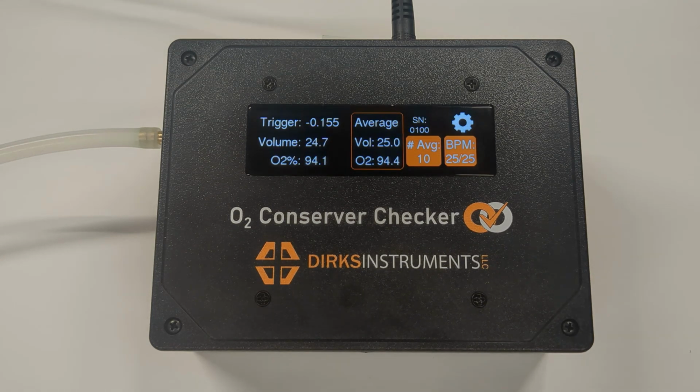On the top right section of the display, we have our serial number for the device, as well as a small area that will indicate if the device is connected to an external device, such as the PC-based monitoring software. When connected, the Bluetooth icon will be visible here. Finally, the gear icon in the corner is where we can access our settings.